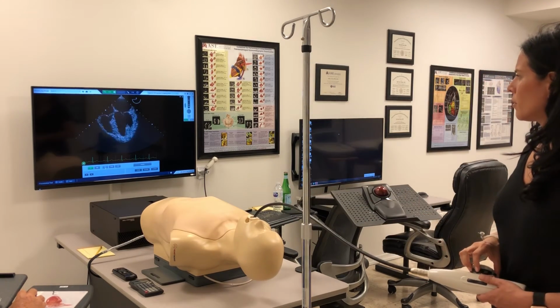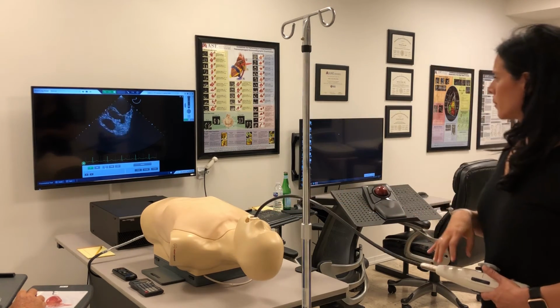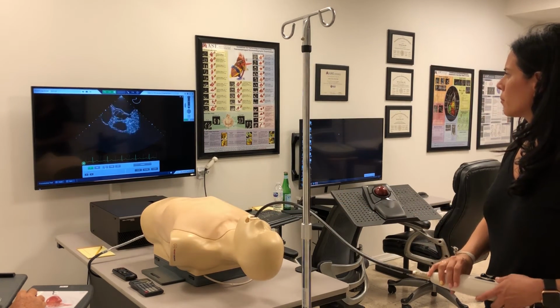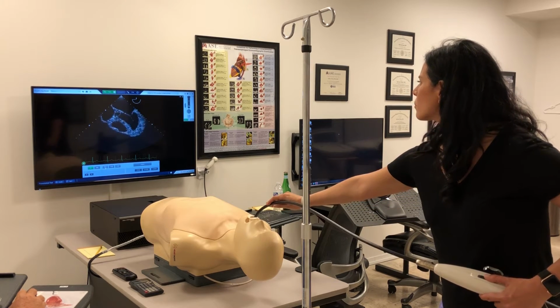I released it. That's okay. Let's go ahead and there. Perfect. Maybe just a little bit deeper so that you're getting more robust left ventricle.